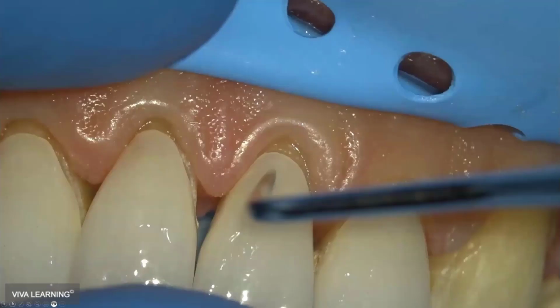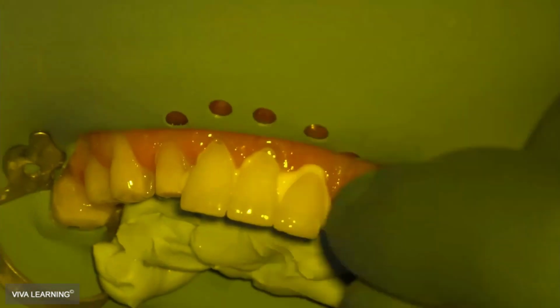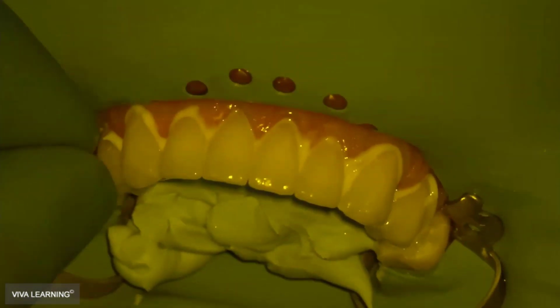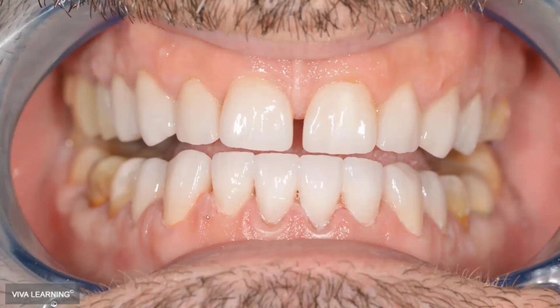These are the provisionals. And here it is at the try-in. I like to check the fitting with the magnification to see if everything fits very, very well. And we do the bonding procedure and apply the veneers. Okay, let's see. This is immediately after the lower veneers were cemented.